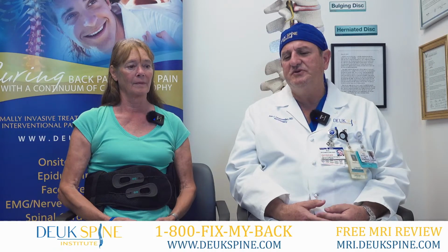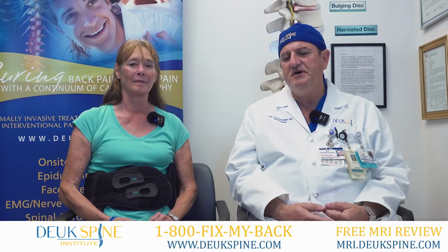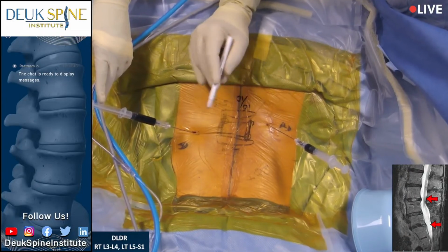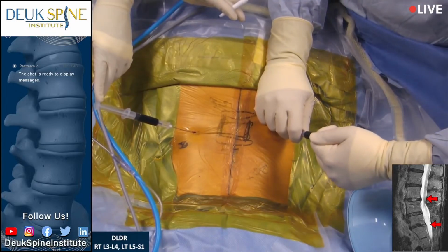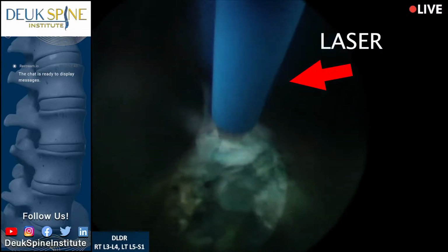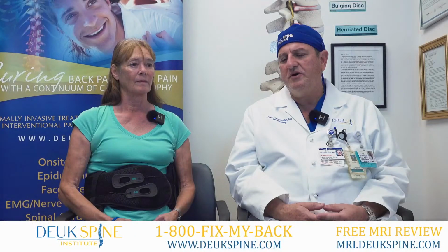And you could see actually the Deuk laser disc repair procedure she had done yesterday. You can see right here, we went into the discs that were damaged. You had 2 annular tears. We tested your discs during the surgery, and indeed they were causing your pain. So we verified that with our discogram. And then I went ahead and used the laser to clean up the tears that were causing your pain and get rid of that source of pain for you. And here you are, you're doing fantastic.